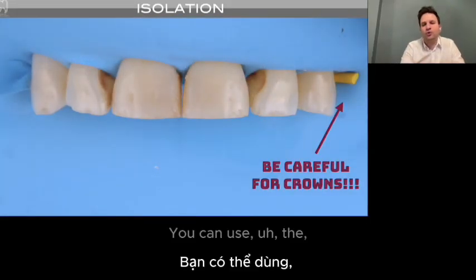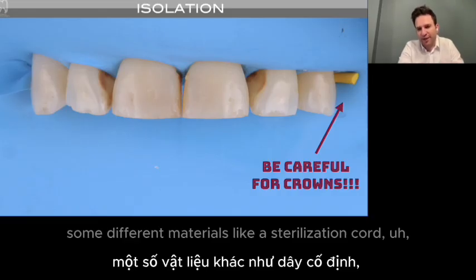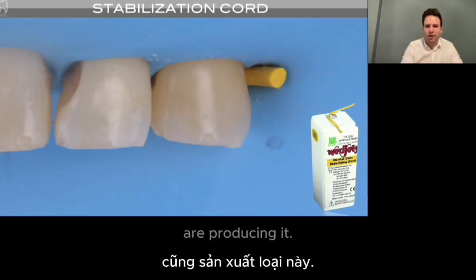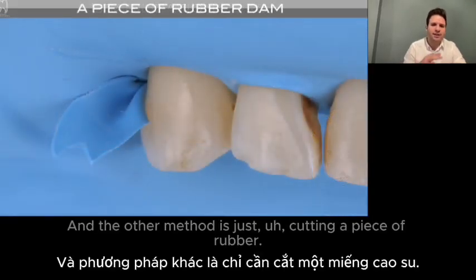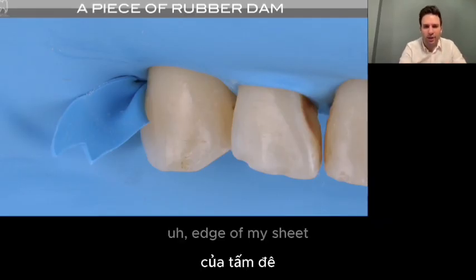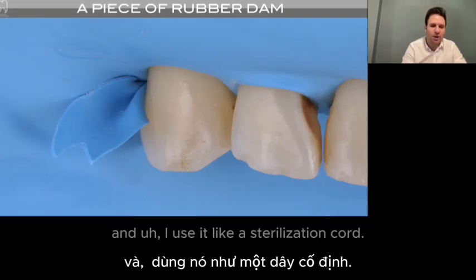Here you can use some different materials, like a stabilization cord from Coltene, or some other brands that are producing it. And the other method is just cutting a piece of rubber dam sheet. I always cut the left lower edge of my sheet, and I use it like a stabilization cord.